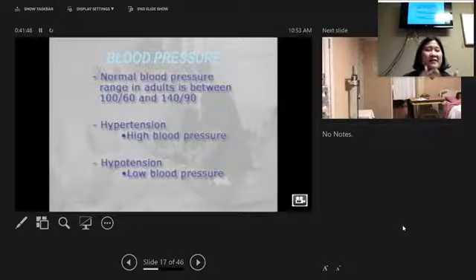But you will hear this first thump. And when you hear that distinctive thump, it's a rhythm. You'll hear your thump, thump, thump, thump, thump. And then you'll stop hearing the thump. When you stop hearing the thump, it's the diastolic number. You can still hear a little bit of a rumble, but you want that thump, thump, thump. Increments of 2 on your measurement.